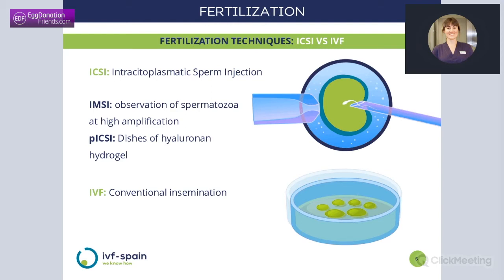So, pros and cons of these two techniques. We all like IVF because it's more natural. So intuitively, it seems less invasive, let's say. The problem is, IVF has more risks because you're not really making sure the sperm cell reaches the place that it should reach. So it can happen that the next day you find there's a failure of fertilization. Basically, none of the eggs fertilized.